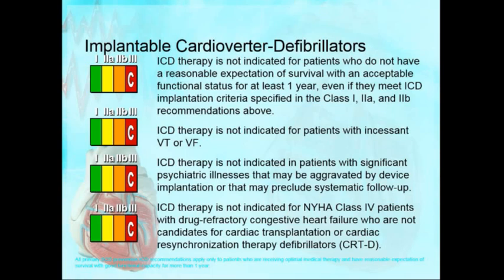That has been a controversy for a long time. So what do you do? The Heart Rhythm Society had a very good, nice statement. You're actually legally okay. If you want to do it, they leave it to the physician. You're okay. I would not do it.